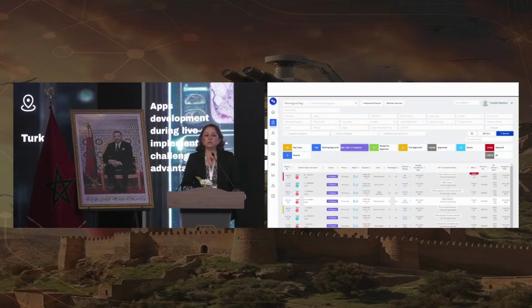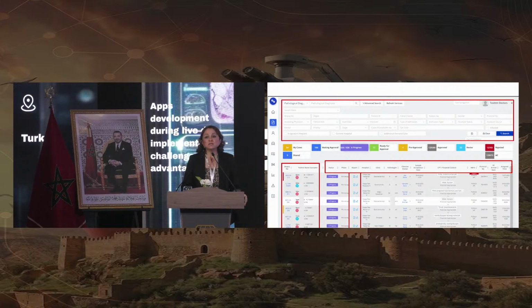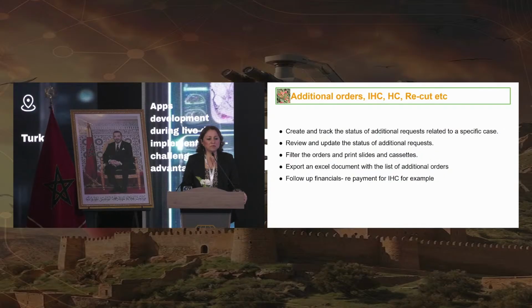And for the pathologist work list, we have priority cases or delayed cases informed here. We can customize our work list, which system we want we can put. We can see the reports directly from the list, and we can search what we want according to which parameter. We can search everything and form lists.